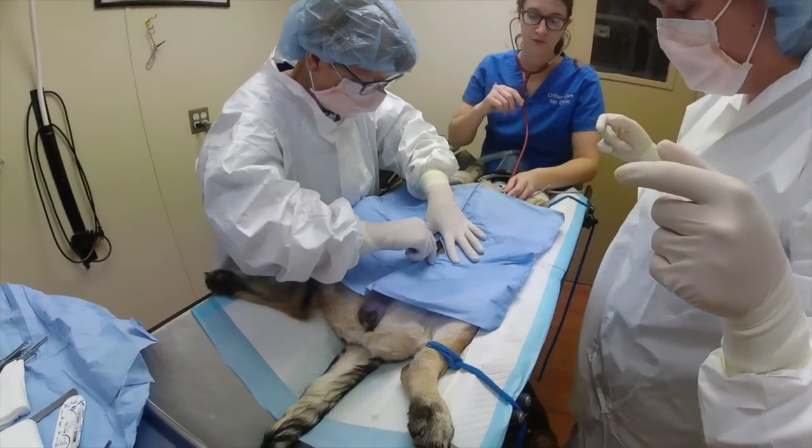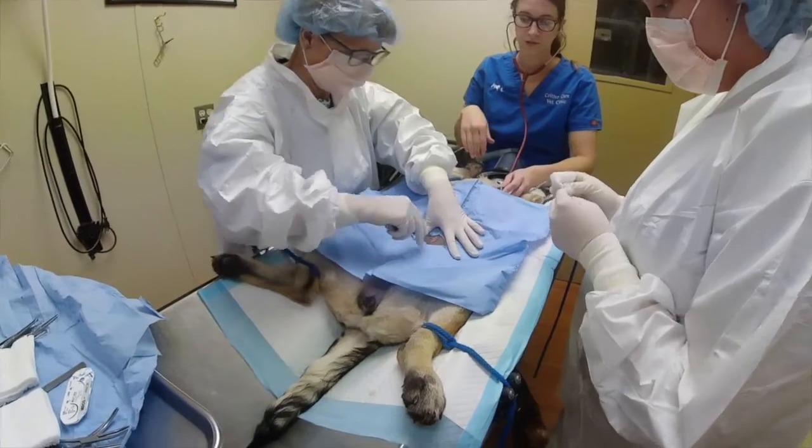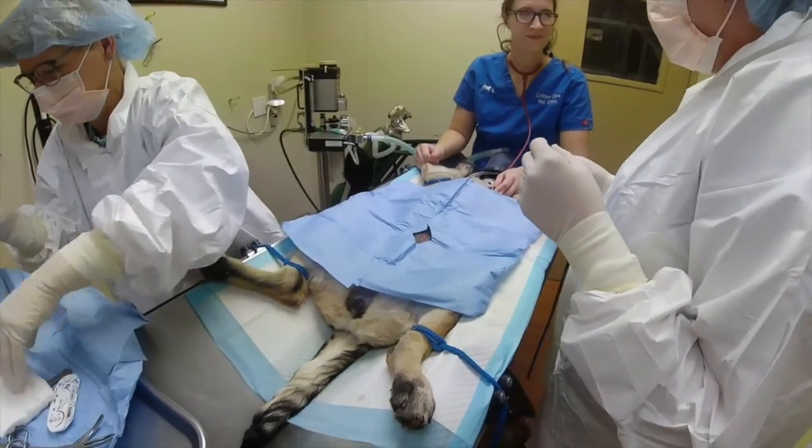Get your 4x4 and you can block whenever she gets enough going down there. Go ahead.